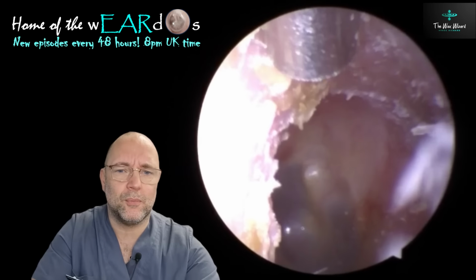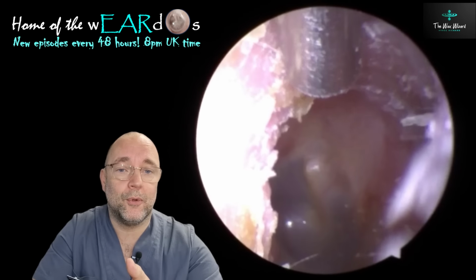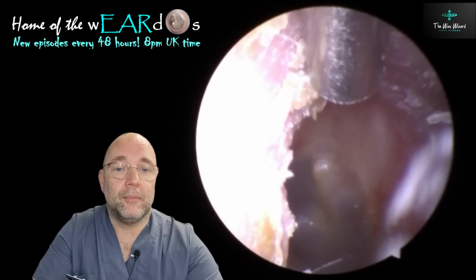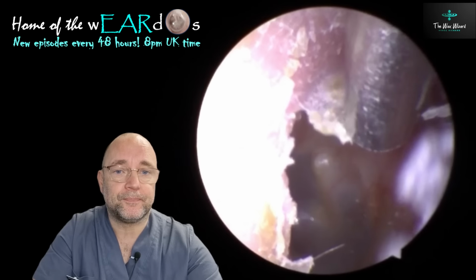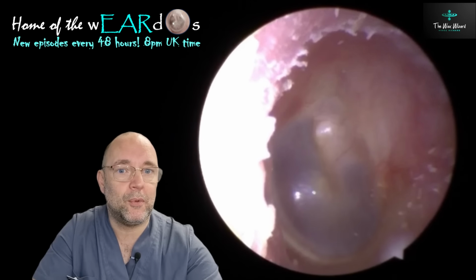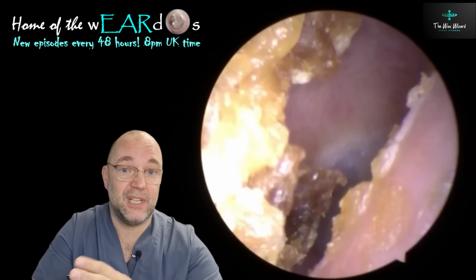I think he's been in two in some compilations. But it goes to show how much better his ear looks when he's been using it. Because he usually oils it for four or five days before he comes to see me. And then going forward, he usually does it once every couple of weeks or so. Because we know it gets dry, as you can see here.